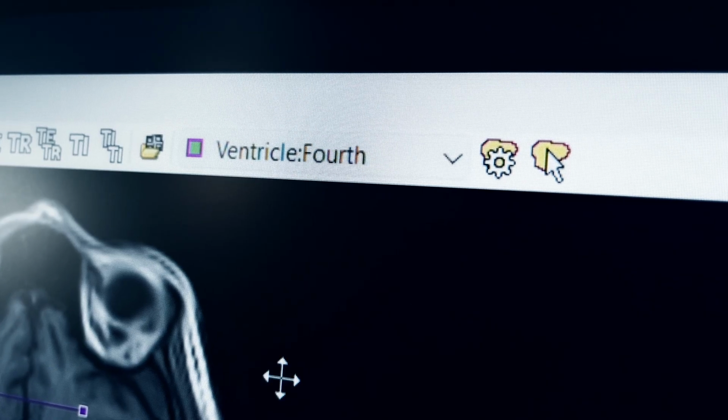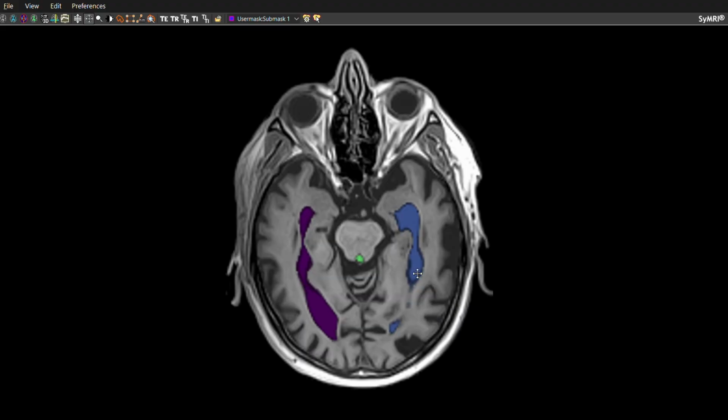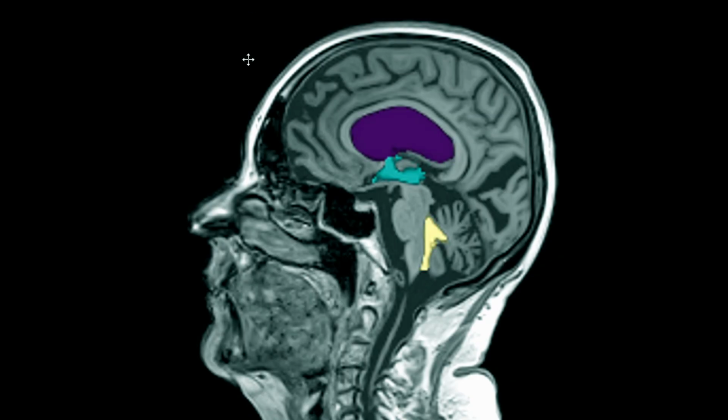By making volumetry easy and accessible, me and many in the scientific community believe that it can help us to identify even subtle changes in brain shape and volume, and that may indicate treatment response and disease progression and maybe even shunt failure as a reason why patients get their symptoms back.